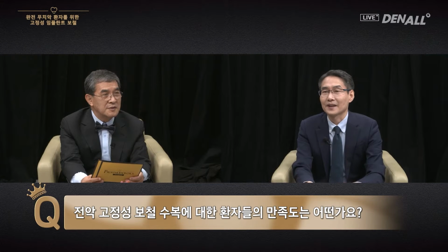When you provide implant restoration to a fully edentulous patient, profile support or lip support becomes insufficient. It can look wrinkly. When I treat an upper edentulous ridge, I always do a simulation using a provisional or bridge in the patient's mouth to see the position and what it's like without flange. I always compare with a denture. I try to make sure that the patient understands that in a denture there is this plastic shaped like a gingiva, but in an implant there isn't, so it can look shrunken.